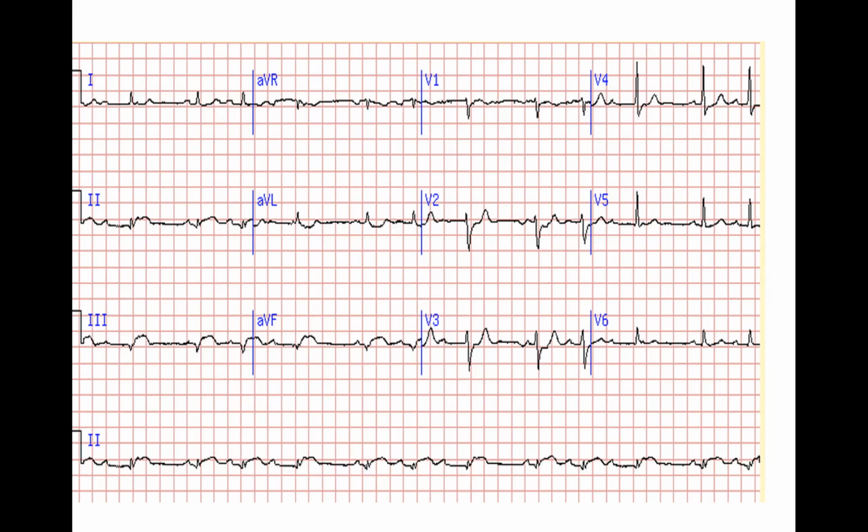I think the one in AVL is sort of not clear also. Most probably it is inferior ST with posterior extension. Most probably, if I'm not mistaken, it's more RCA than LCX because of the lead 1 and AVL, if I'm not mistaken. Sorry, that's all I can say.